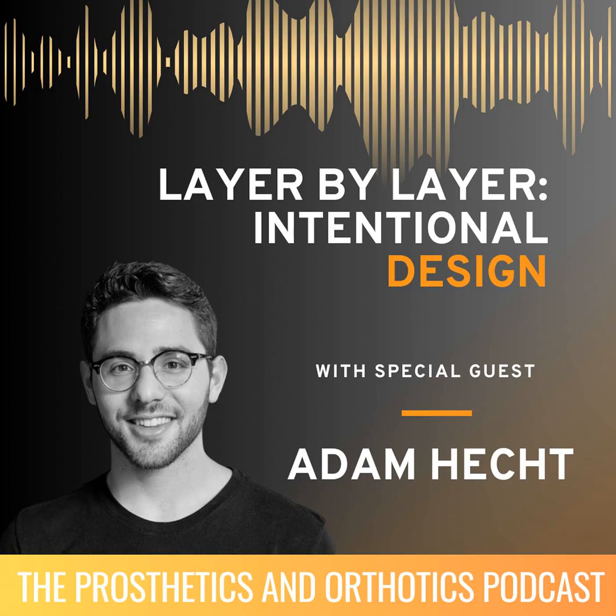He would print these essentially lattice patterns and he would thermoform them to create really interesting designs that you really couldn't make any other way. And he would mold them and he would create these really elegant, custom prosthetic feet that were modular. He was just doing all this amazing work. He was winning hackathons and he was partnering with all these other designers and prosthetists.